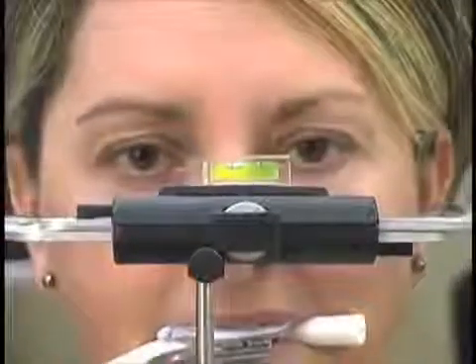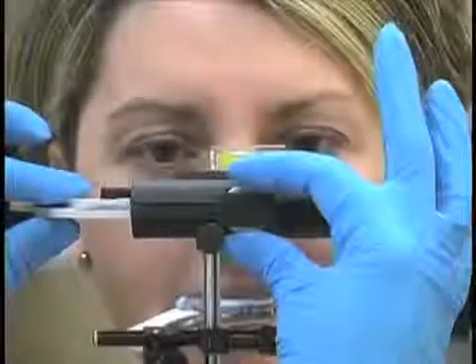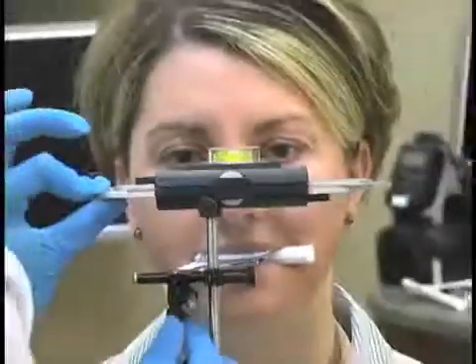And as Pete has said, using interpupillary line is one option, but it is possible for that plane to be off. So I love the fact that Whitmix has placed levels on the Facebow. So if you look at Ann now, notice that the Facebow is on her face. We've tightened number 1, okay, and got it right where it's supposed to be vertically. But now we're going to look at it horizontally, and we see that that bubble is slightly off. Without taking the Facebow out of the patient's ears, what Mariah can do is just very simply move it in the patient's ears till that's level, and then reach down and tighten the second one.